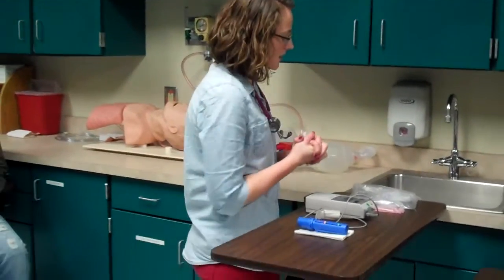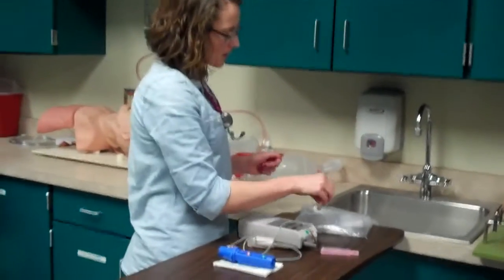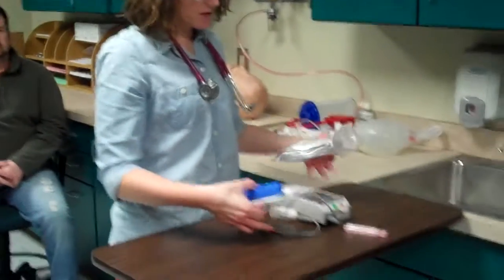Okay, this is Victoria doing her medication aerosol checkoff video. Go ahead, Victoria. Okay, my requisition comes down. I have to give a bronchodilator to Daryl. So I'm going to grab all of my equipment.